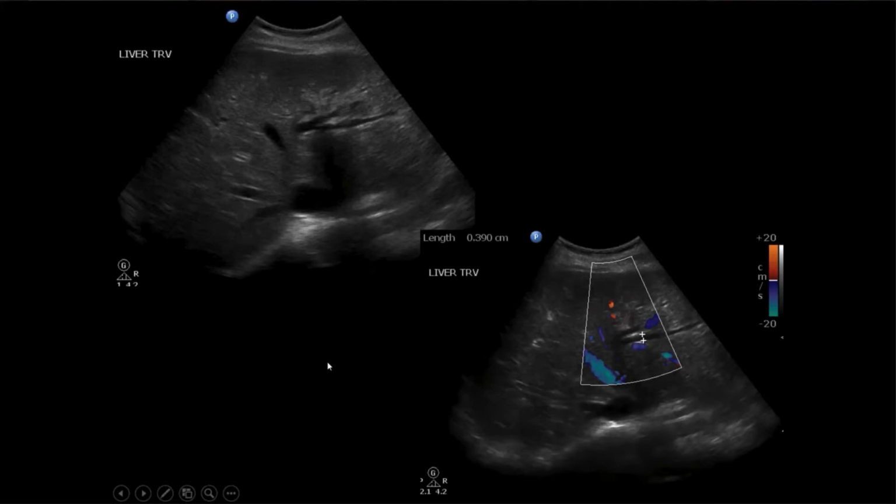You're scanning for their gallbladder and you're looking at the liver and you're thinking, oh wow, these are kind of fat. There's too many of them. I'm going to put some color flow on this and see if I can tell if it is the intrahepatic ducts. So the criteria for whether these are dilated or not: if they're bigger than 2 millimeters in diameter, it's considered intrahepatic biliary duct dilatation.